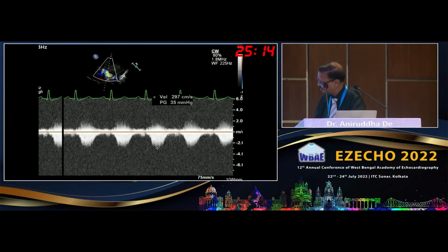Yeah. See, the contrast will go everywhere. The first thing is that it is an anterior mediastinal mass, superiorly located. Anything outside the heart, obviously echo has limitations, and cross-sectional imaging like CT is better. However, I think the best thing we can do is vascular versus non-vascular.